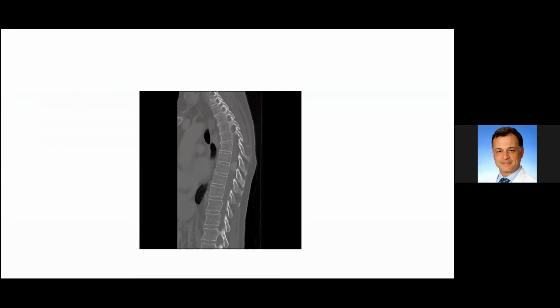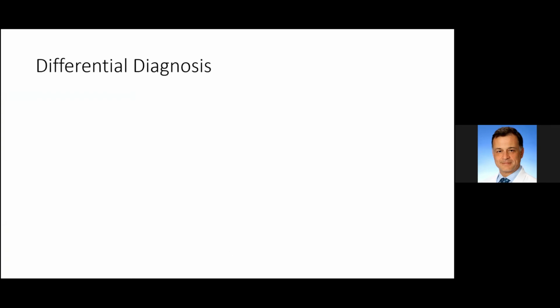If something looks like an obvious meningioma, which this does, and you only had one other test you could order, I would say CT was probably the most valuable in terms of diagnosis, and also telling you how difficult the surgery is going to be, because if it's calcified and like a rock, and especially if it's ventrolateral, it's going to be a much more difficult surgery than if it's not calcified. Excellent. Perfect.